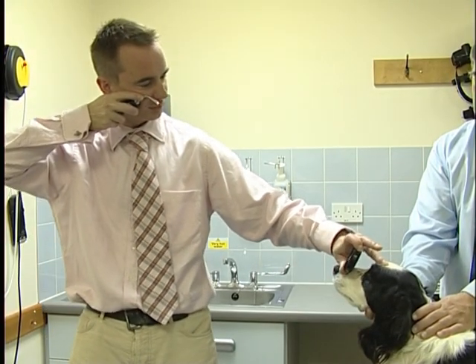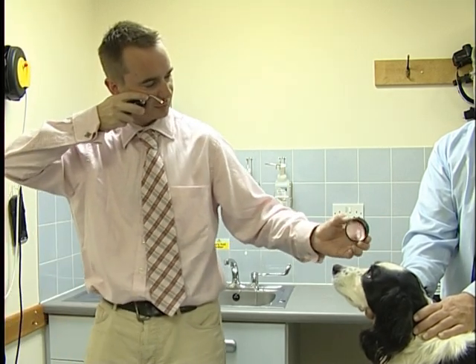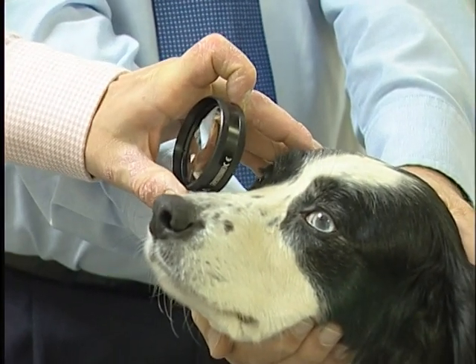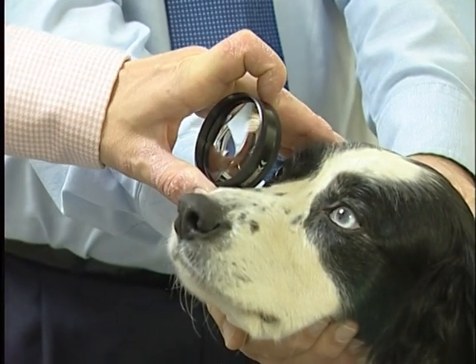With this technique, the examiner can observe through a dilated pupil approximately half of the tapetal fundus, and with minimal movement, a picture of the entire retina can be quickly obtained. Once this technique has been used for scanning the retina, close direct ophthalmoscopy can be used to have a closer inspection of any lesions discovered, and also for a close look at the optic nerve head and retinal vasculature.